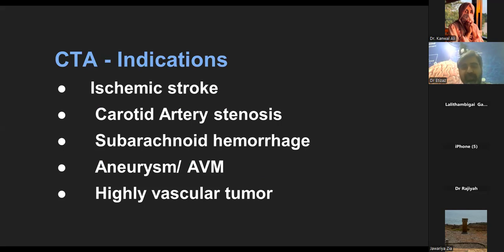We thought previously, and we are thinking, that angiography is only helpful for any pathological vascular structure. But nowadays, when you are seeing a very highly vascular tumor on the CT scan or the MRI, then you can go for the angiography as well. CTA, the most likely. Why? To see the arterial supply to that tumor, because operatively it's very important to address that vascularity earlier.